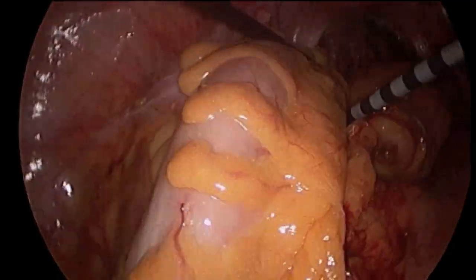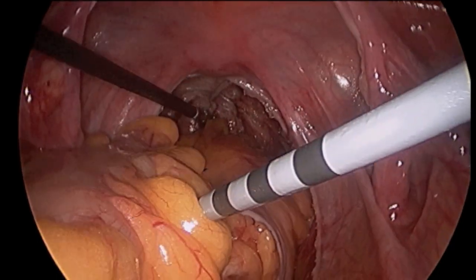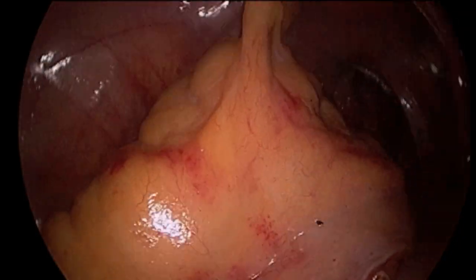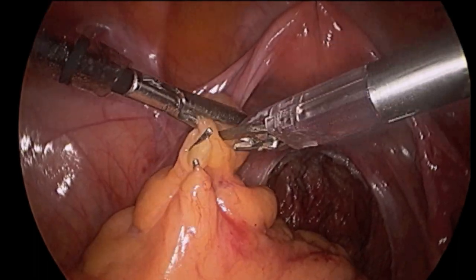Next, a point along the sigmoid colon is chosen for dissection and division. The area must be mobile enough to reach the remaining rectum, but high enough above the tumor so that the important mesorectum lymph nodes are removed. The chosen site is marked with clips.